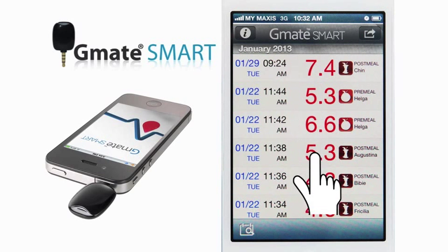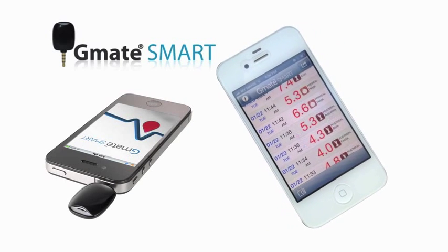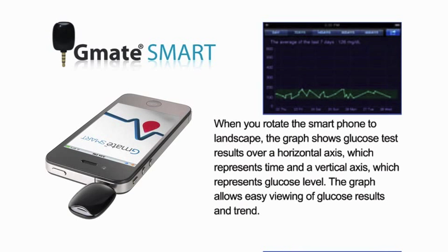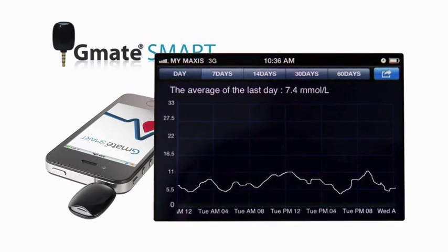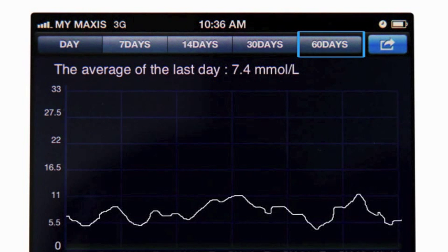Touch one of those results and the detailed information will appear. When you rotate the smartphone horizontally, the results convert into a graph which represents your glucose level. Touching the button at the top of the graph will change the zoom level and show the average of the last specific period.